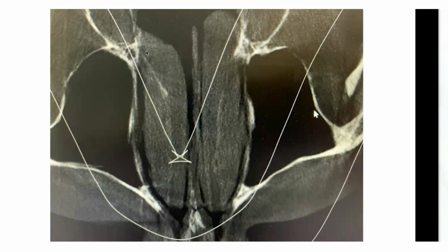Here is an example of turbinates. We're looking at a cross section. These kind of gray areas right here in the nasal area are turbinates. Black is airflow. Black is where the oxygen gets through. And so even though the sinuses are clear, the nasal area is almost completely blocked because of those turbinates.